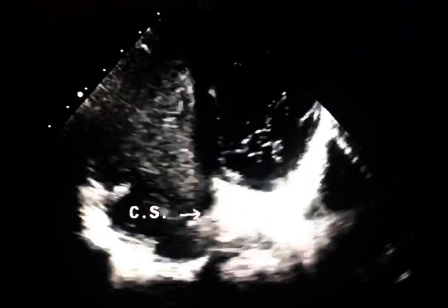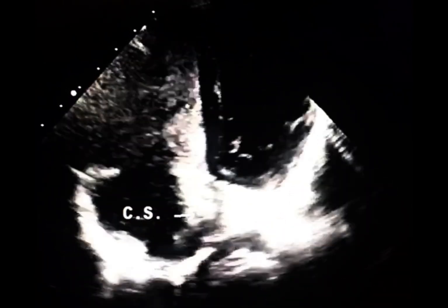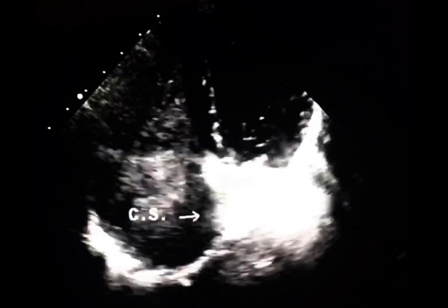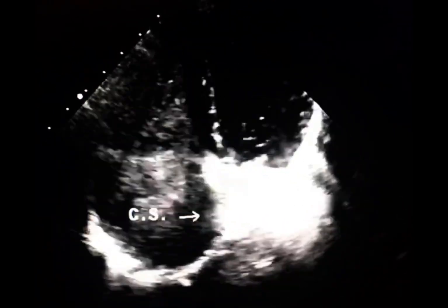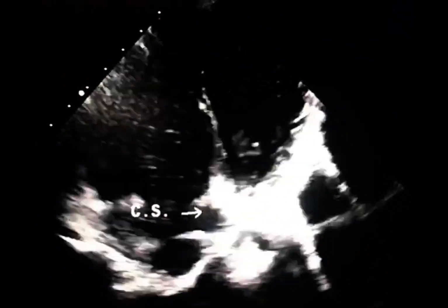This contrast study shows contrast bubbles passing into the right atrium through the coronary sinus instead of the SVC. This view is characteristic of a persistent left SVC. The persistence of a left-sided SVC is the most common anomaly of the SVC.